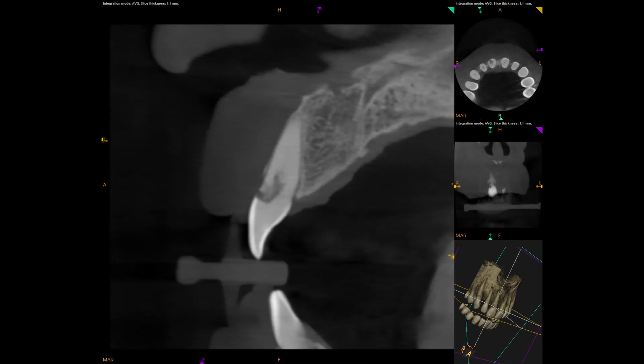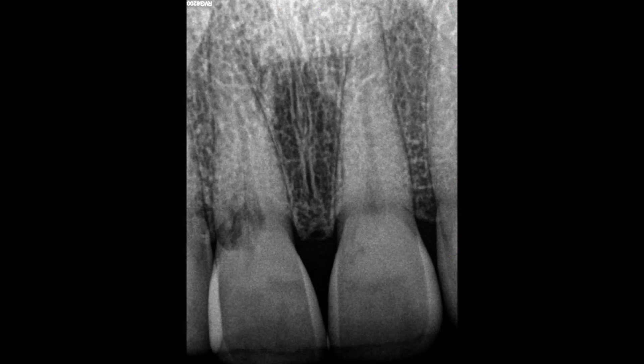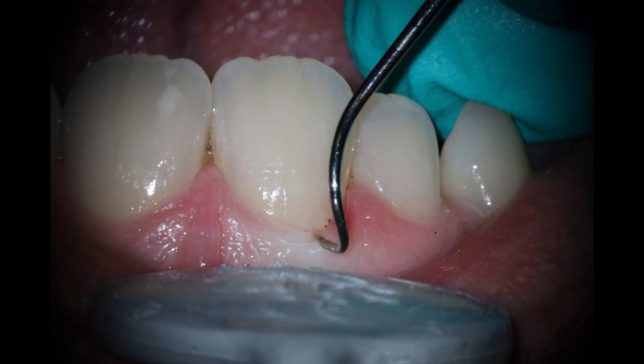You can see it's right along the buccal surface there. It does kind of go down a little bit sub-crestally, so Heithersay class three to four-ish as far as this one. It wasn't bad enough that extraction was recommended. You can see there I was able to get a probe into it as well, so I knew we were going to start seeing some issues here.